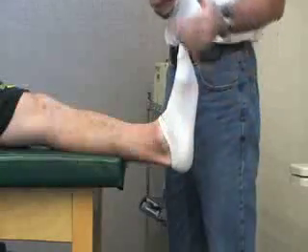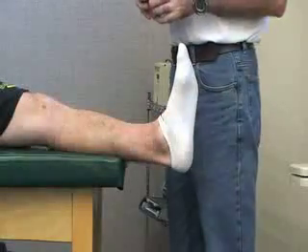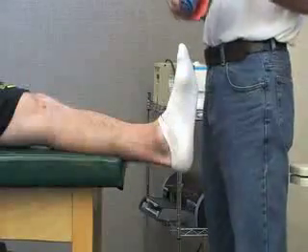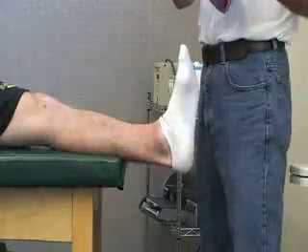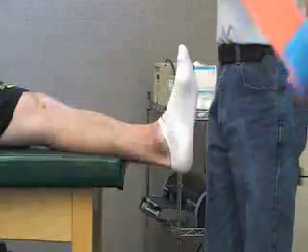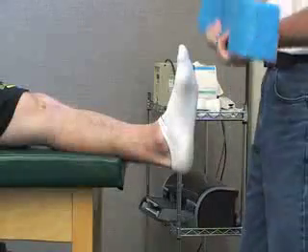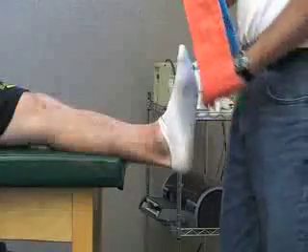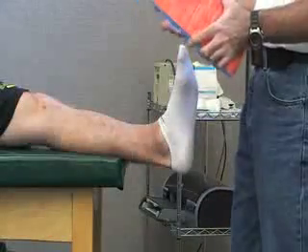For this one we notice that the shoe is off. We also want to, when we put this piece on, unroll the SAM splint all the way. The first thing that we want to do is find the foot part — the center of it.